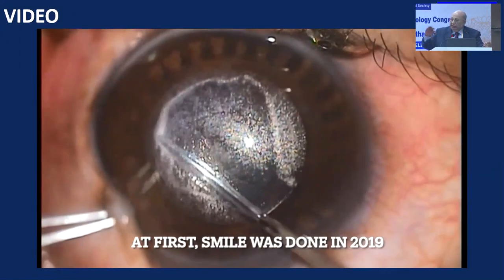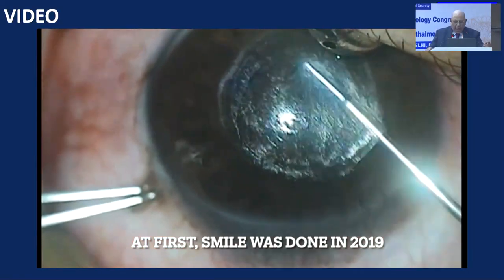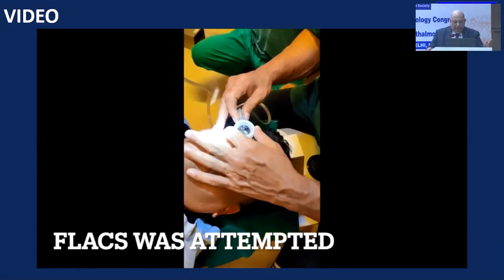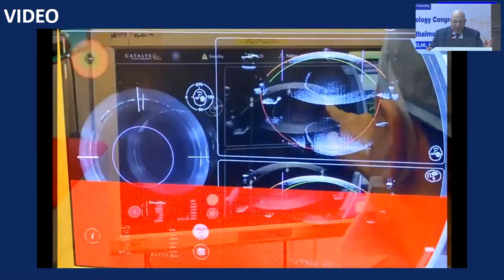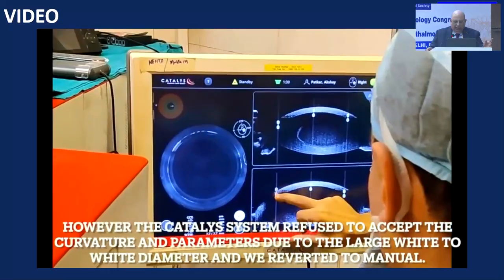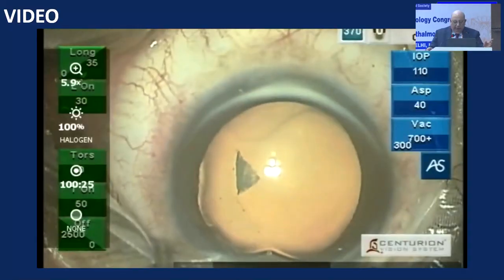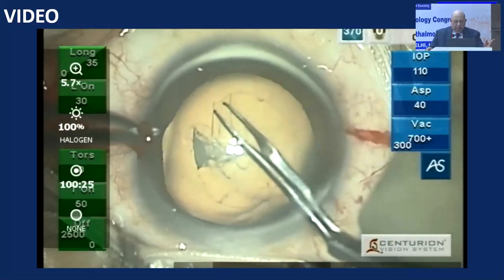This is a short video of the procedure, how it was done. Essentially, you can shut the sound. First, the SMILE was done in 2019, and then subsequently in 2024, the patient returned with a cataract. FLACS was attempted. Unfortunately, on a megalocornea, it does not accept it. As you noticed, despite the multiple trials, it refused to accept it. It just does not fit.